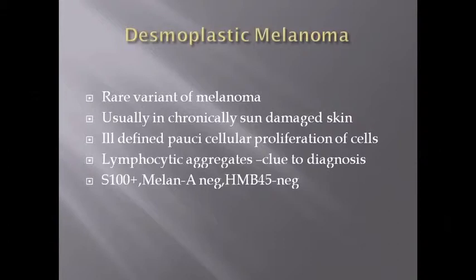You can imagine the situation if only some of those cells are S100 positive and not as beautifully stained as I have shown now, because even when you do an S100 staining in a scar, you may find some cells staining positive anyway. So that can add to the confusion, and also if the biopsy is tiny or superficial, again, you're confused as to, oh, could this be a scar? Could this be a desmoplastic melanoma?